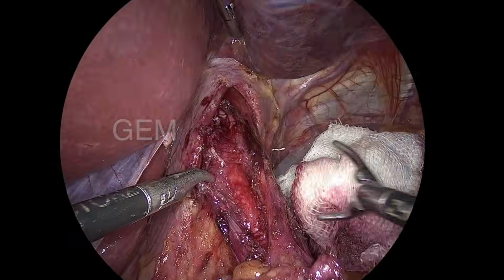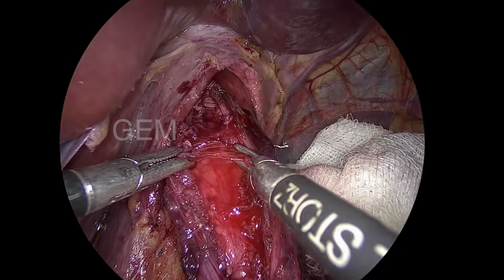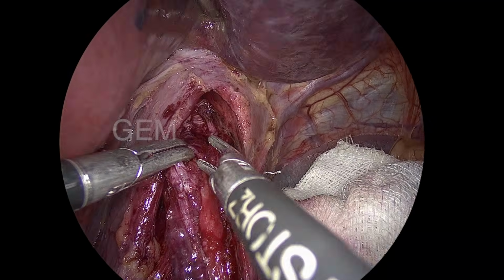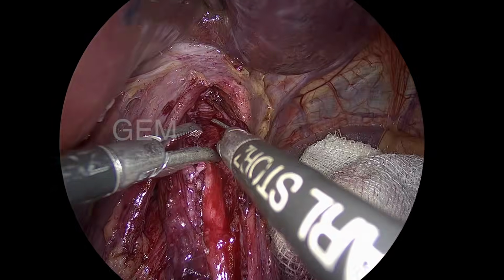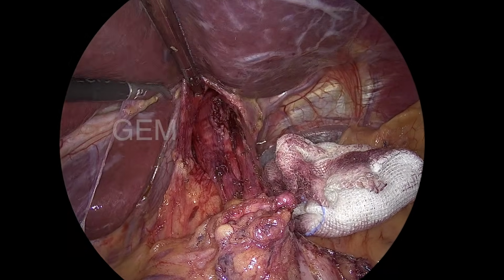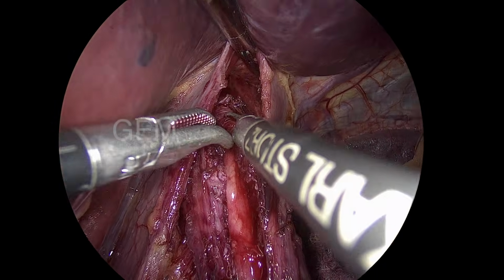During this time the Ryle tube will be pulled out, and I keep the Ryle tube in the mid esophagus. After the myotomy I can introduce the Ryle tube, then I place the air, and then I do an air leak test. So, I am going up. I divide the longitudinal muscle for some distance, almost around 9 to 10 centimeters from the OG junction, and I am going to that level. That is enough, there is no need to go up.